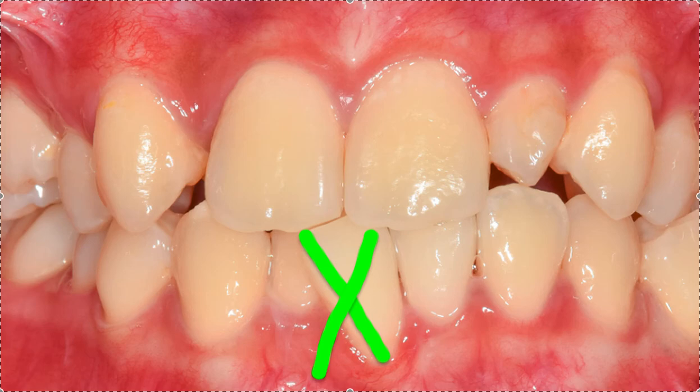They can just wear it during the day if they want to. They don't need to wear it at night. It's just when they feel like they need to, for people to see it. I wouldn't necessarily wear it while eating, but if they want to, they can. It might protect the space and make it more comfortable so that food's not hitting the area.